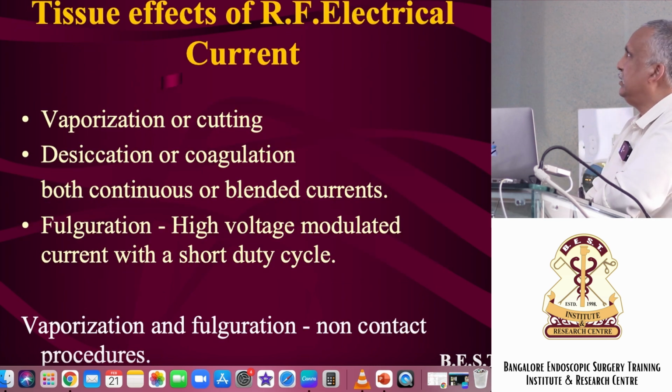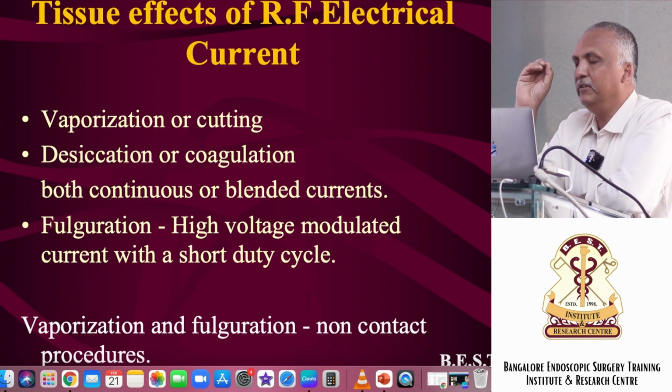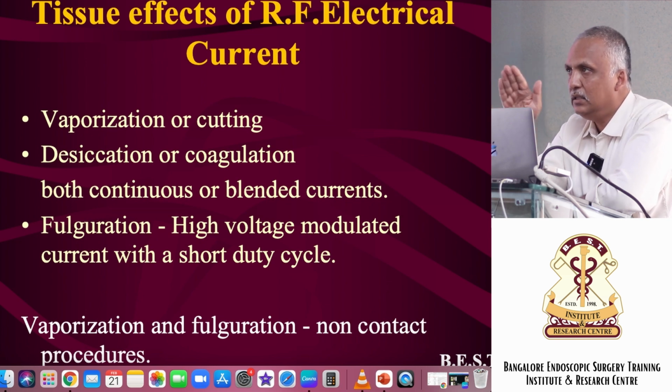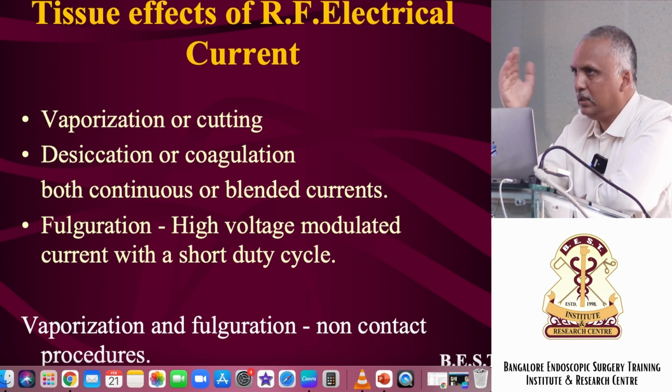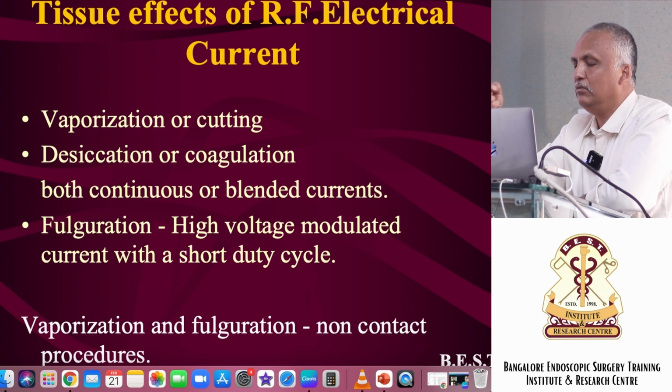Now, tissue effects in radiofrequency current. So there are basically 3 different effects that happen. One is cutting, another is coagulating, another is just superficial coagulation. You have a liver bed, you removed the gallbladder, it is all bleeding. You don't want to desiccate it like an artery, or you are catching an omentum, or some vascular structure, and crushing it and then cauterizing it to nicely stop.